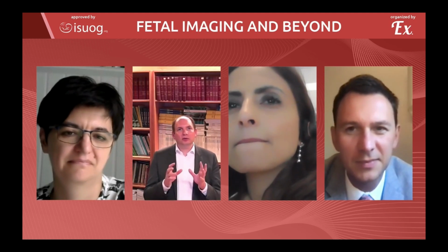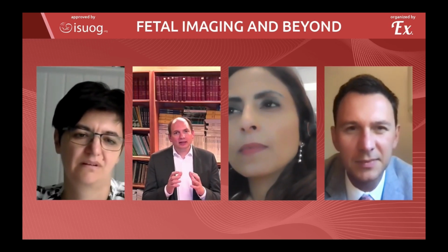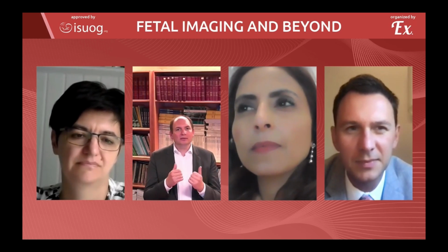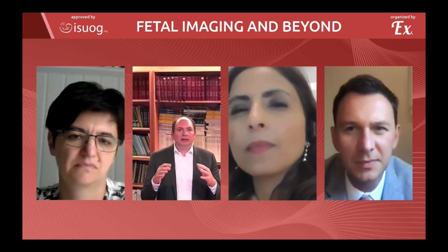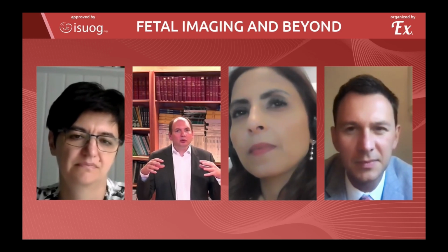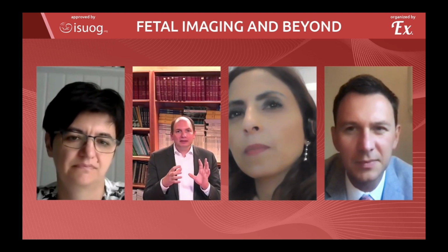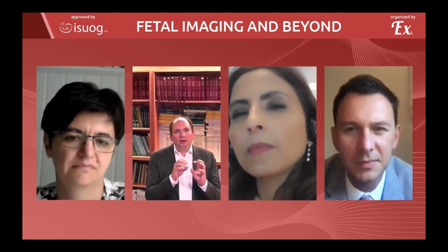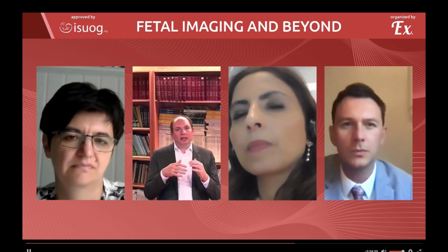I have seen changes to the corpus callosum, but I think they are secondary. If you have an early CMV infection also affecting cortical development, leading to polymicrogyria and abnormal neurons, and these neurons then have abnormal axons, they might of course be misguided, and the corpus callosum is thinner, smaller, maybe a little bit dysmorphic. But a corpus callosum that is entirely missing is very, very uncharacteristic for CMV. Okay, that's reassuring. And maybe one last question about this MRI.